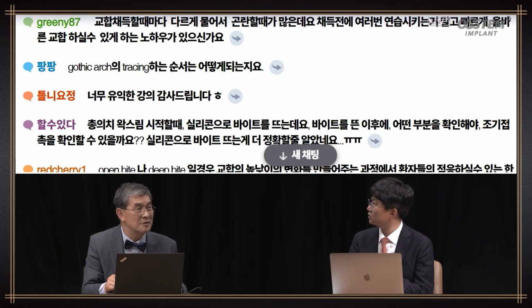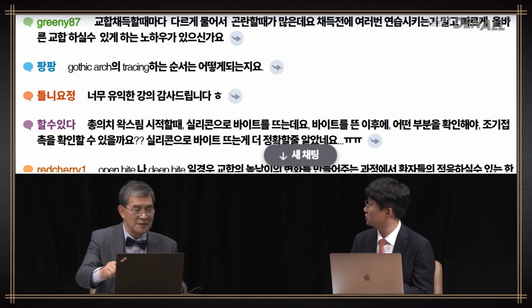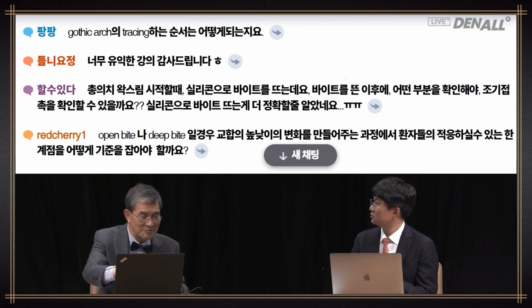If it is thick, the patient would feel a foreign object. The myoneural system would be adapted in a wrong way, so the occlusal area should be reduced, and the patient should be instructed to close and open the mouth immediately, and the wax rim should be cooled in cold water, and the tapping would be confirmed one more time.